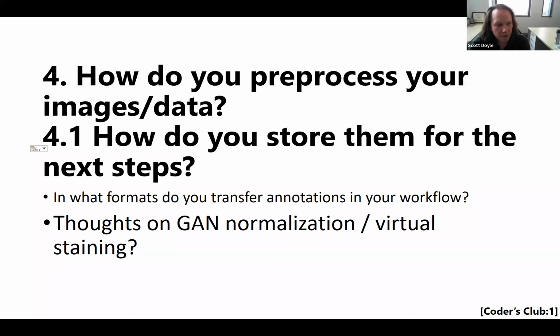In my opinion, the way to deal with normalization is about looking at data from as many sources as you can and grabbing as much actual data as you can. Now, if you're limited in the amount of data that you have, then you can do augmentation. GAN for augmentation, maybe, but I actually have a student now who's working on a project where he's comparing GAN augmentation versus using actual samples, which introduce actual real world variability into your training set, which I think is far more valuable.